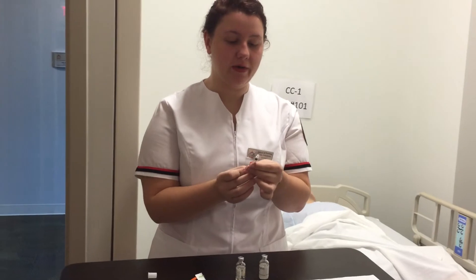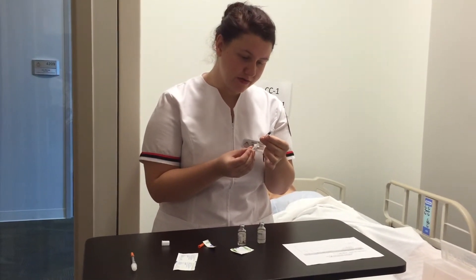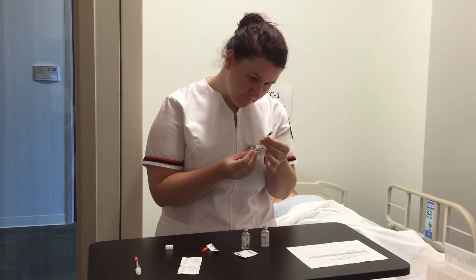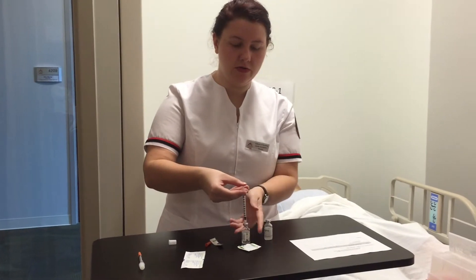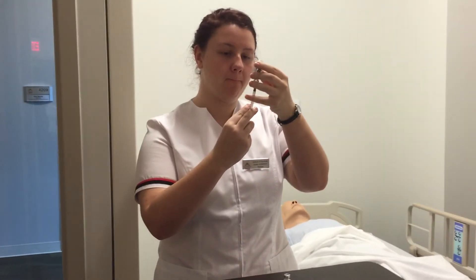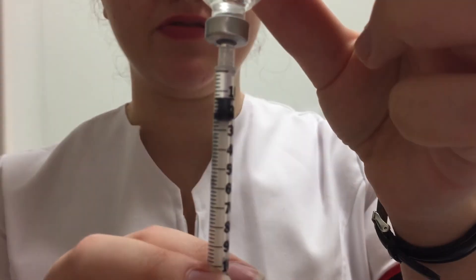Now I'm going to pull back 12 units of air for my regular insulin. I have 12 units of air — I'm putting it into the regular, inverting it, and pulling back 12 units. I would check for air bubbles, then verify with a registered nurse that I've pulled back 12 units of regular insulin.